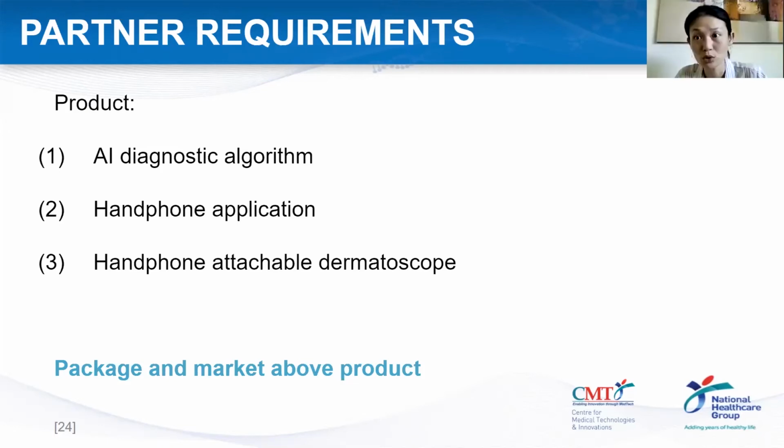Okay, so the dermatoscope itself, only dermatologists will buy because nobody else uses it. Each dermatoscope, depending on the brand and the function, some have dual light, some can see with light, without light, that kind. So it ranges from about 400-500 to easily about 1,000 plus. And the dermatoscope has to be charged with time, and of course it will spoil with time, so you've got to change one every 3-4 years, depending. So that's the dermatoscope, but only dermatologists buy it.